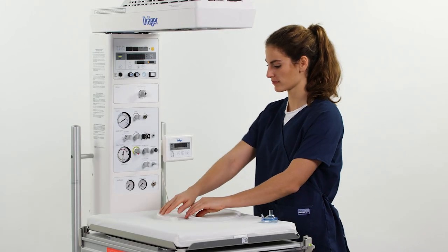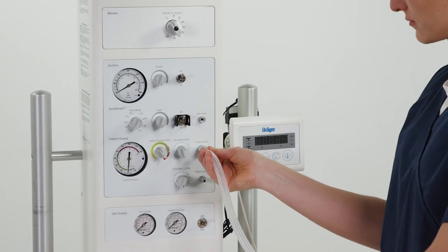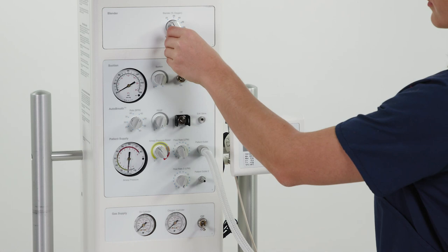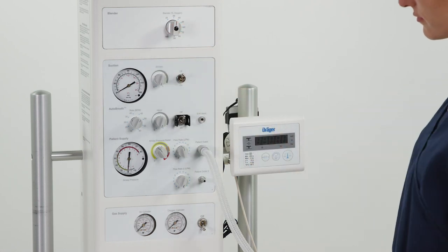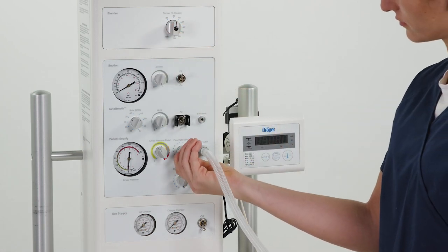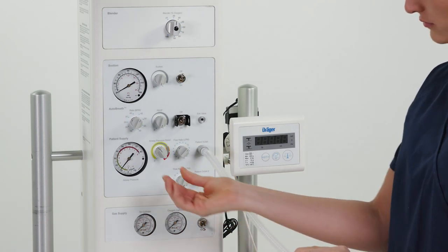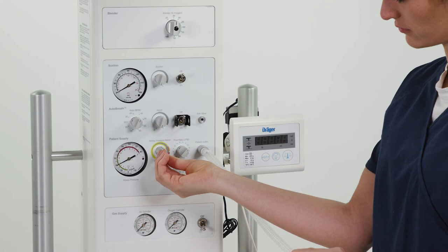T-piece resuscitation. Connect the T-piece breathing circuit to the patient outlet. Go up to the blender and set FiO2. Go to the resuscitation module and set the flow rate, setting airway pressure relief or PIP. Set the knob to the desired setting.